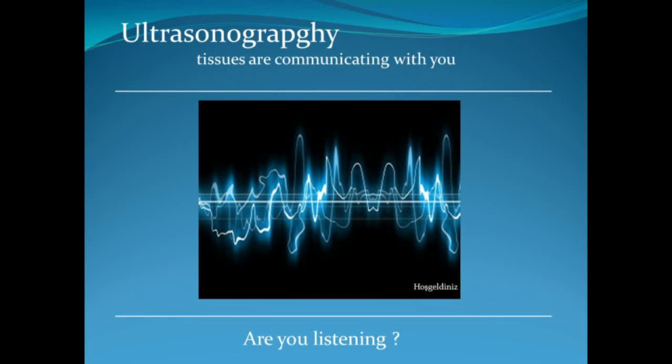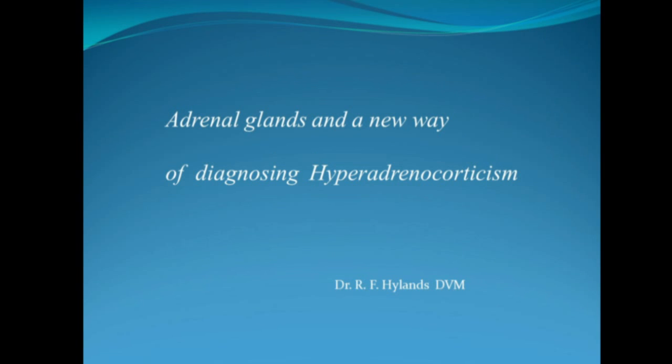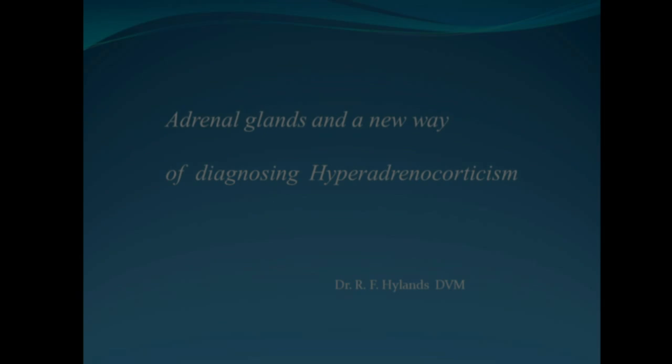Welcome to our presentation on ultrasonography of the adrenal glands. With the question in mind, are you listening to what your sound is telling you? So the whole point of this presentation is to take a new way of interpreting ultrasound imaging of the adrenal glands, and I think you'll find it interesting, although a bit controversial.